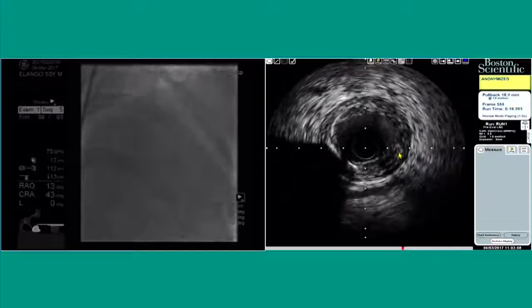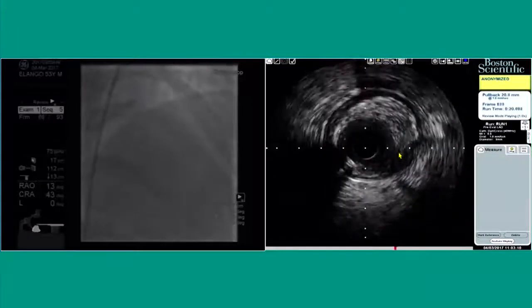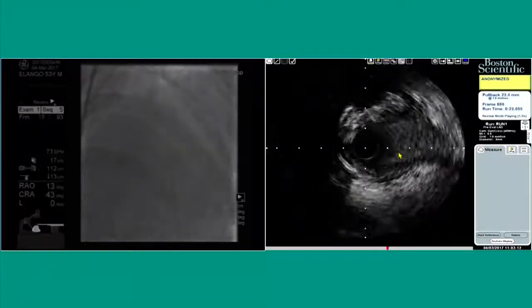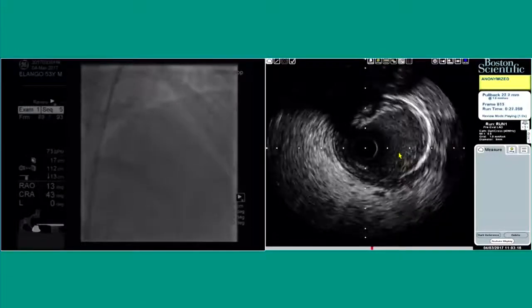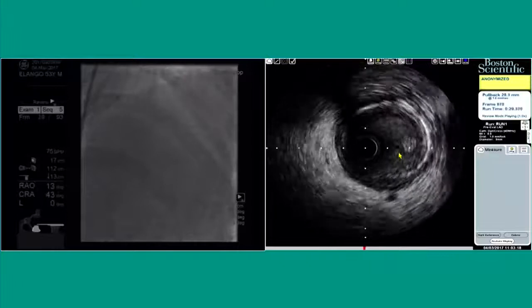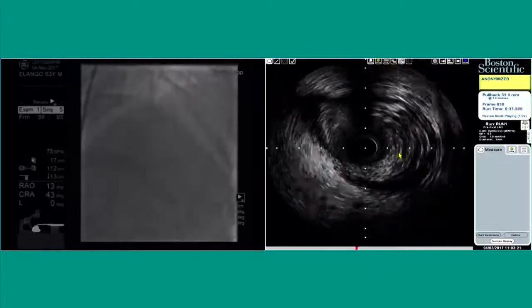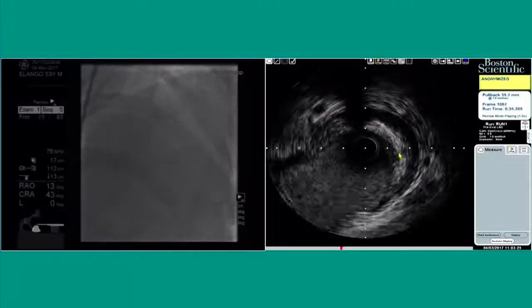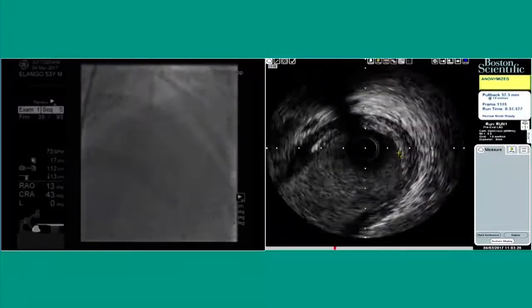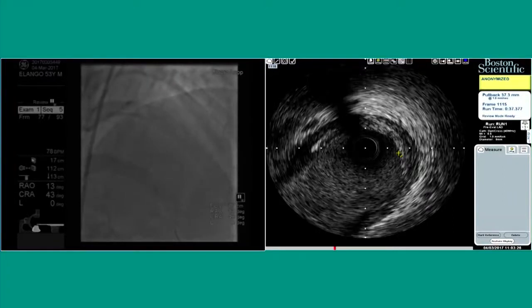270 to 360 degrees is this. And that was in one part. I guess that was the part which was okay. Most... which is where you'd actually have the... some more calcium coming up. Yeah. And okay, one principle in life I've learned is that if you think rotational atherectomy, do it. Because when you don't do it, that's when you actually suffer the most. It's not during doing it that you suffer, it's when not doing it that you suffer.